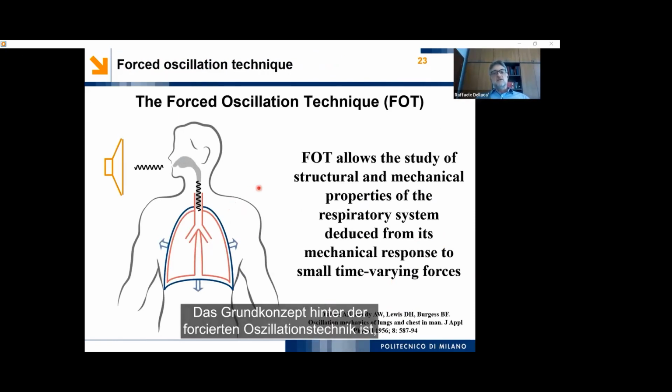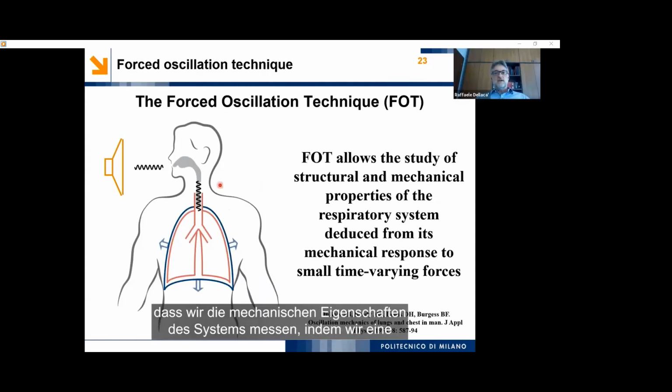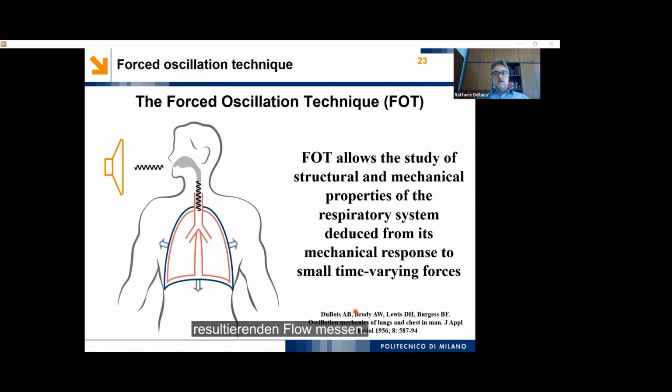The basic concept behind the forced oscillation technique is that we measure the mechanical properties of the system by applying a high frequency, low amplitude pressure variation at the airway opening, and we measure the flow that is consequent to this high frequency component.